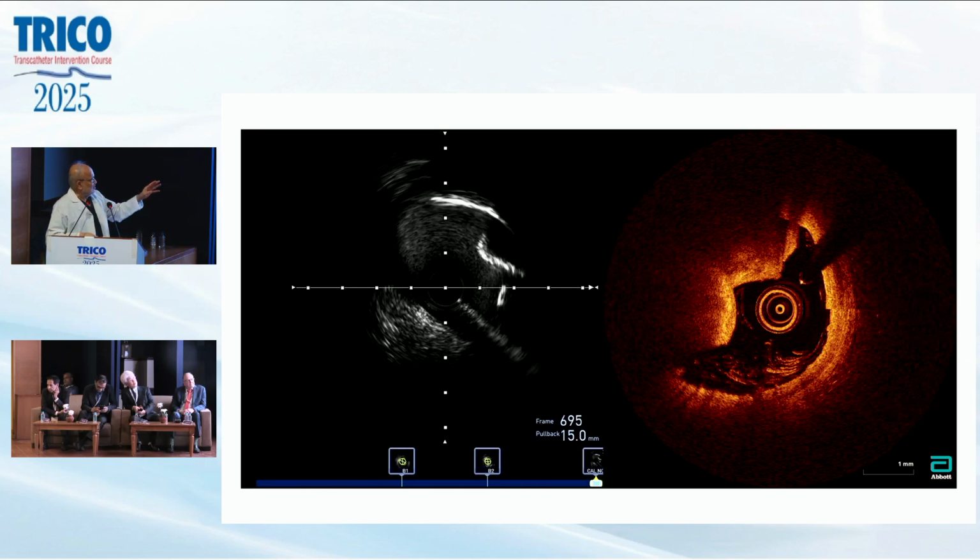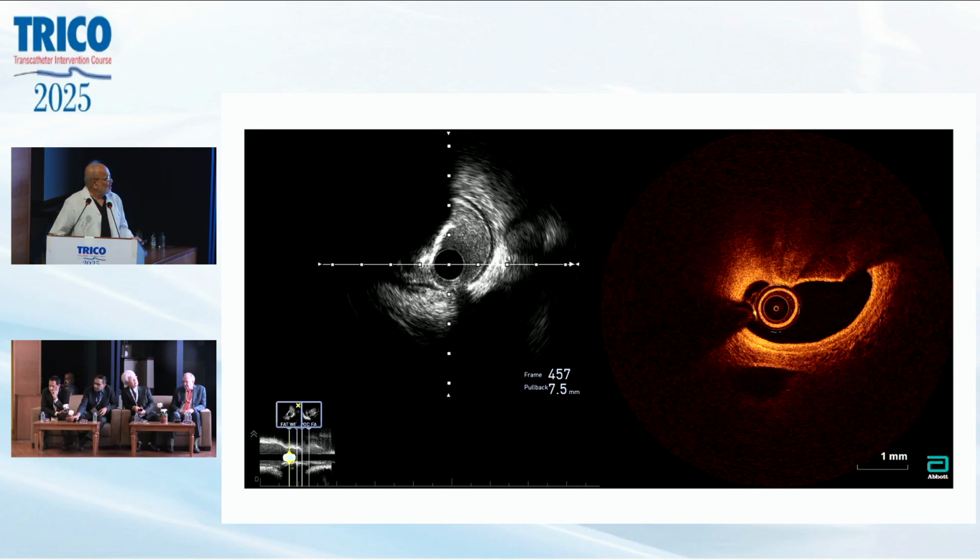This is the worst. It's ugly, whatever you do, and if at all something will help, it is orbital atherectomy. Neither balloon, because it will rupture, nor IVL. The balloon has high chances of rupture and it won't work. And this calcium is a very bad calcium. Orbital atherectomy may blunt this sharp area, and then you can work with the technology. This is a very sharp calcium, with very high chances of rupture.